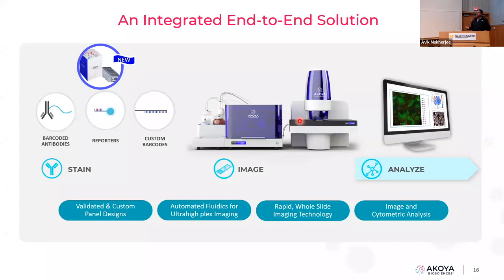The file is a QPTIFF extension that can be used to do image analysis using any third party, any free open source software that is available. So we haven't blocked the analysis in that way. We have kept it open.